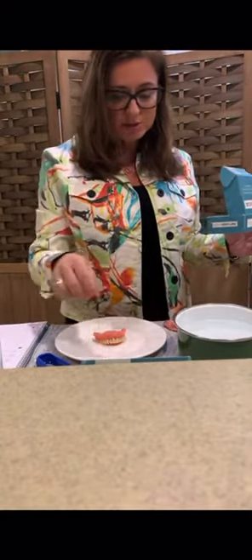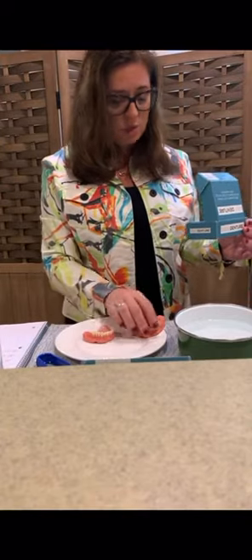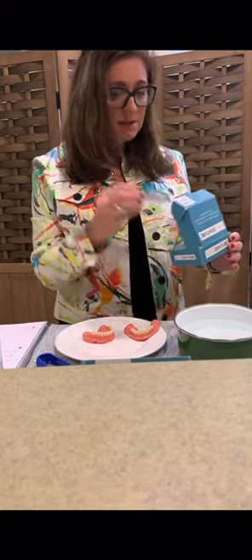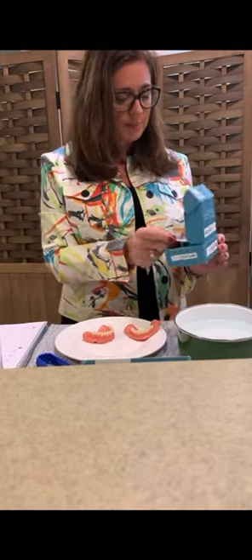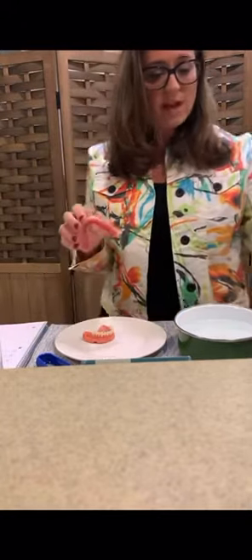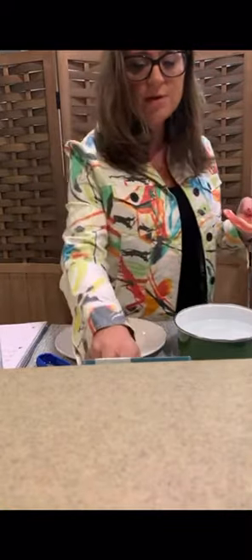This is what it comes in — your box of Easy Denture. It's sold per arch, so you either purchase the upper arch or the lower arch. They do not come as a set. You have to decide what you want. It comes with some fixodent and some cleaning tablets.